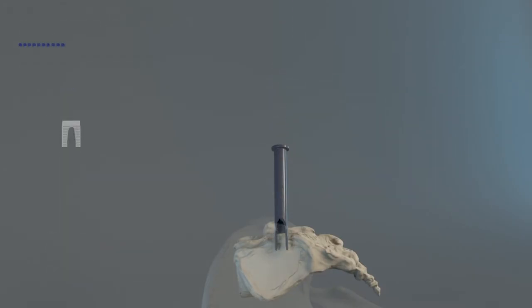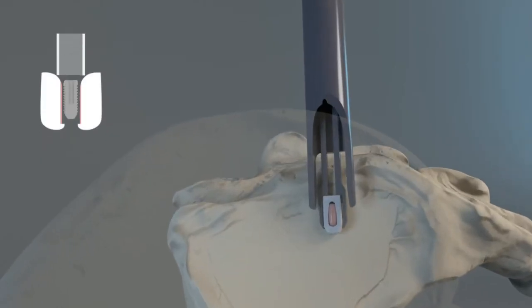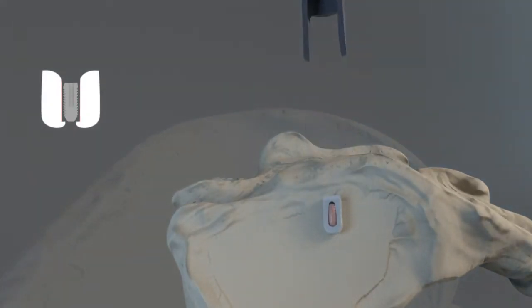Finally, a large graft window of the link allograft is filled with DBM and placed into the SI joint. The inserter ensures that the link is positioned perfectly, allowing SI fusion to begin.